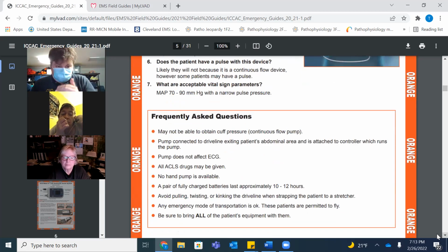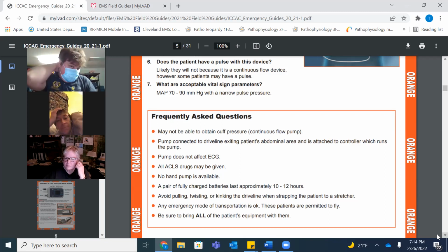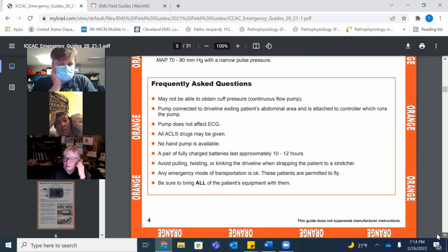So this is just a quick short sheet on how each model would work. And for a while, we were keeping them on the ambulance. I'm going to double check and make sure that we have some ability to access that resource. So if you are out on a call and this happens, you can refer to this guide and it will be helpful. We did for a while have one in the full, it's like with a hazmat book and things like that that we kind of just stuff away and don't really give a lot of thought to because we don't deal with it as often, but it's a resource that's available to you.